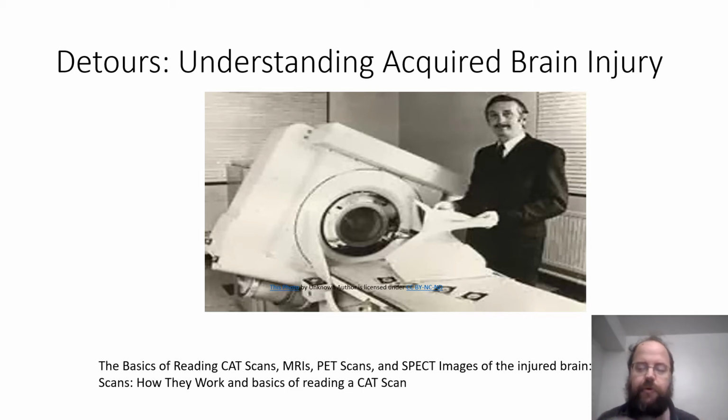We're going to talk about the earlier, more primitive methods of imaging the brain because there were a number of ways they could image the brain, but the problem was most of these were more primitive, and so they were painful generally and provided very little useful information. You had to rely on a good clinical exam and a lot of doctor's skill in interpreting these.